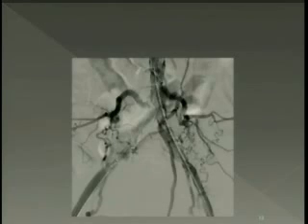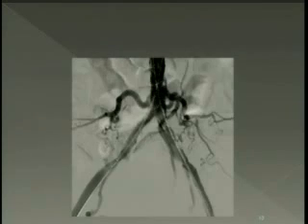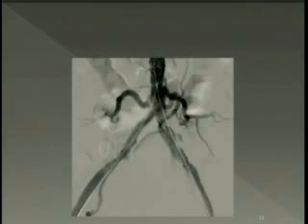But the brachial approach does have more support compared to the contralateral side. You have a good seating of the catheter across the occluded CTO of the left iliac, and then you can push the wire very well. Going via the contralateral, you are not going to have good support because your catheter has to take a curve across the bifurcation of the aorta. Yes, I agree with you if you have a very calcified lesion.